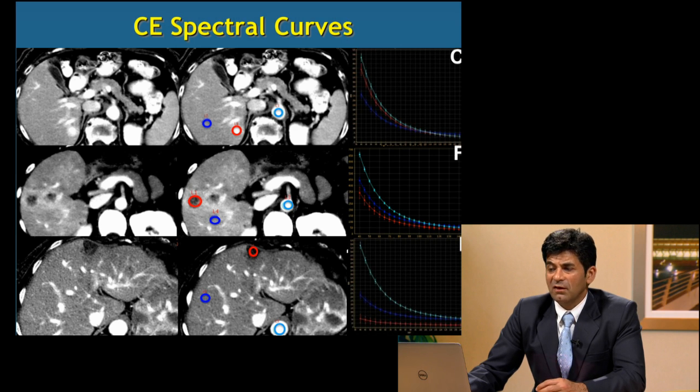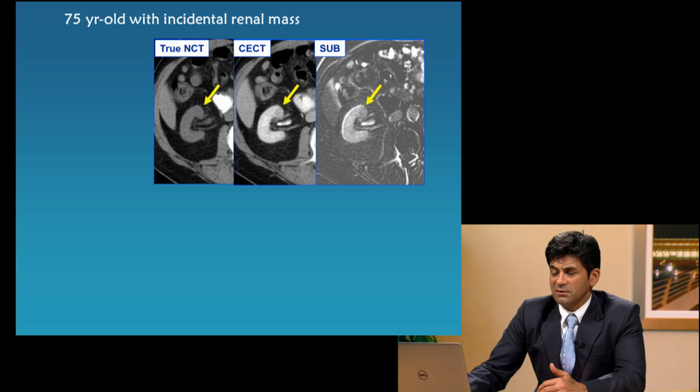So these are some additional features that are available that one can apply when needed for better tissue characterization.